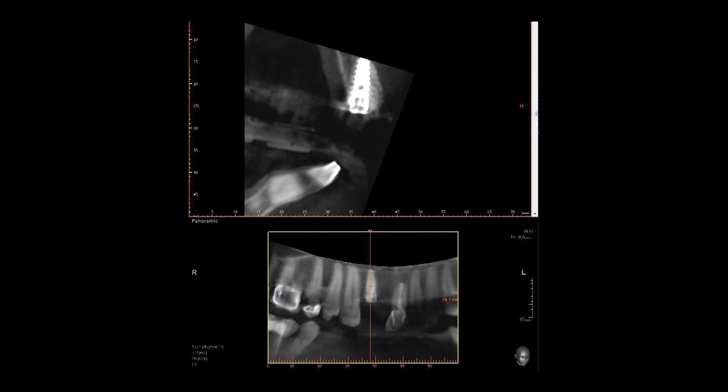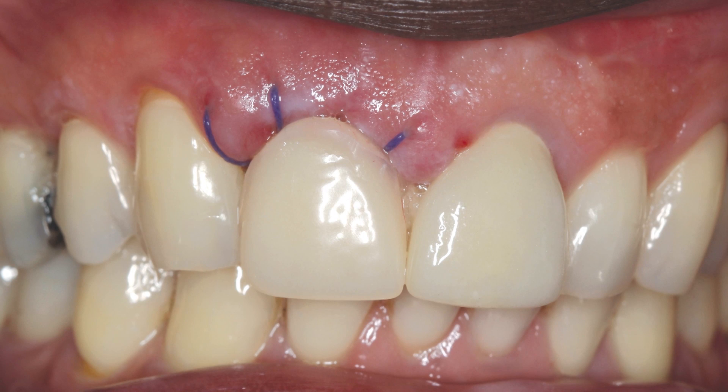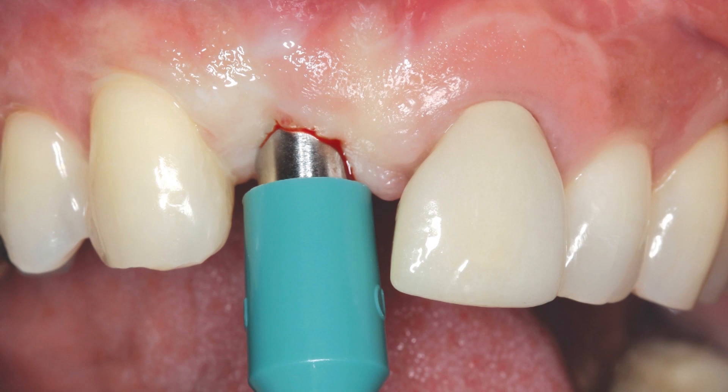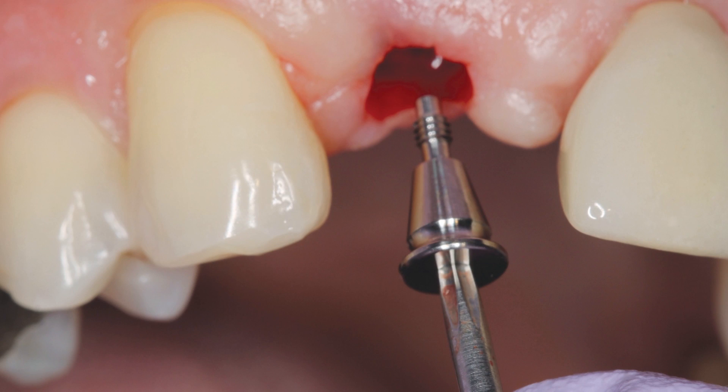Figure 13 shows the post-operative CBCT scanning and illustrates that the implant was positioned optimally. Following 7 days of healing, the sutures were removed and the site was allowed to heal for approximately 4 additional months, after which the patient returned for the final impression appointment. A round tissue punch was used to access the implant site, causing little trauma and allowing immediate final impressions to be taken using an open tray transfer assembly. A final impression was made using vinyl polysiloxane materials as seen in figure 17.